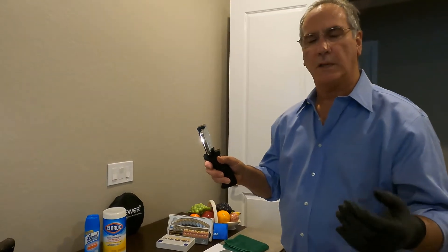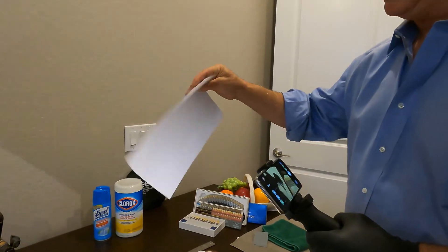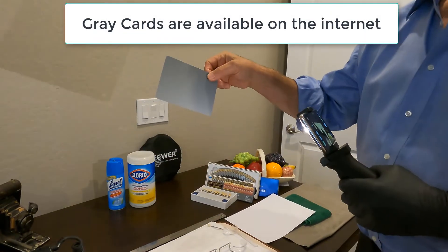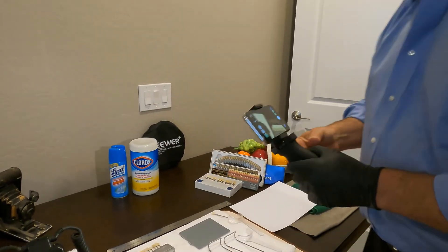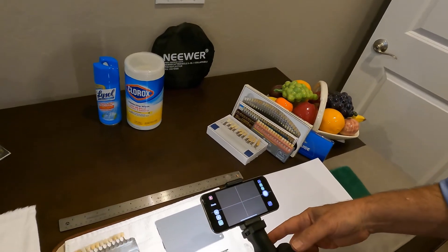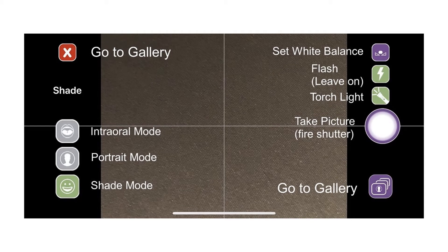So let's go through the process. You can use either white paper, which obviously all of you have, but what's a little bit better is the photographic gray card. So all you do is set that down, and I'm going to get about 5 or 6 inches away so that in the camera you only see the gray card.